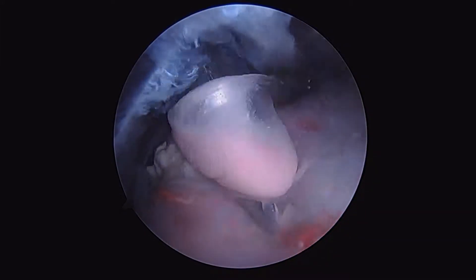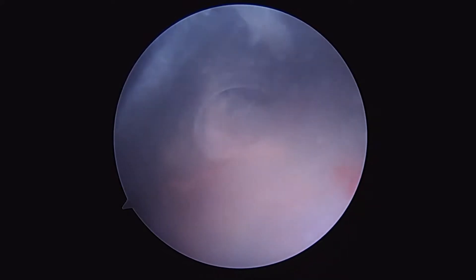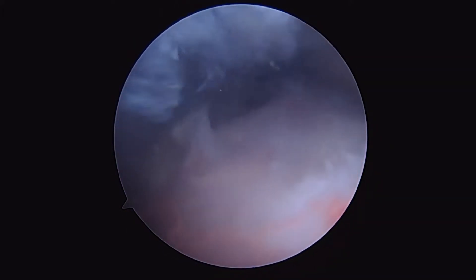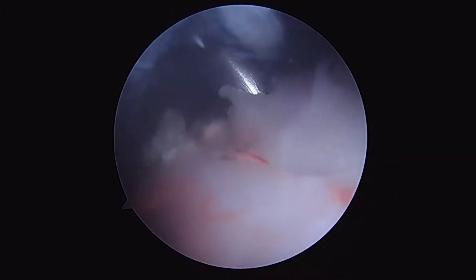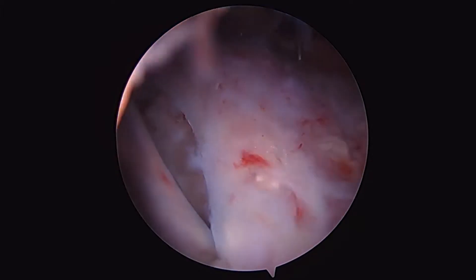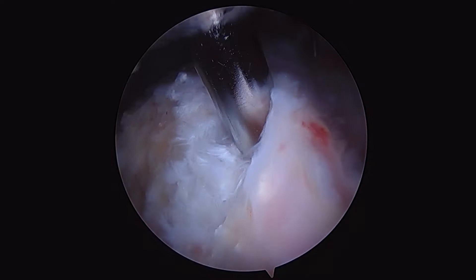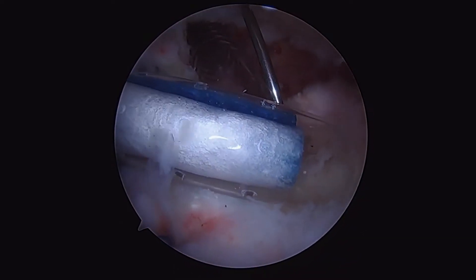Here we can see the volume of the deposit coming out. We're going to go ahead and evacuate all of this deposit, but unfortunately this is going to leave us with a very deficient tissue volume. So we're going to use a standard suture anchor to affix the tendon back down to the bone, but then we're going to augment this to reduce our risk of failure utilizing the bioinductive implant.